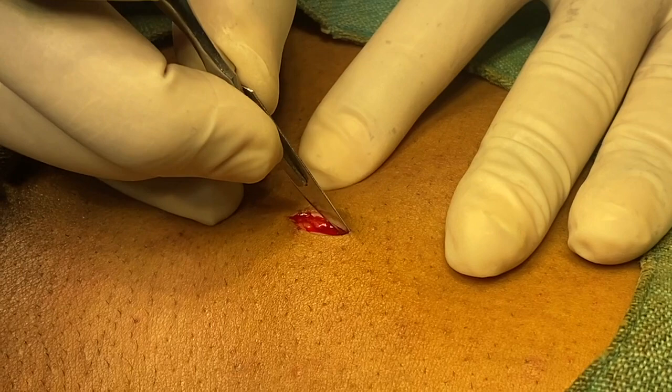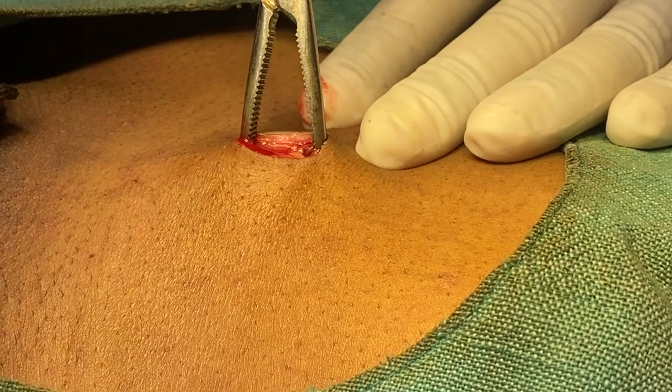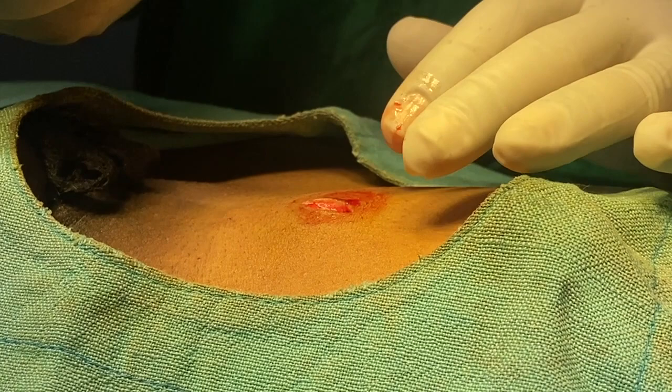The rectus sheath is the most important thing we need to incise, because that is the only structure which will give resistance. We have only incised the skin and subcutaneous tissue and are now spreading the tissues with the hemostat, doing a blunt dissection until we reach the rectus sheath. The rectus sheath is a tough structure — it is not easy to either dissect or cut. With a finger we palpate the rectus sheath and with a vertical knife we cut it.